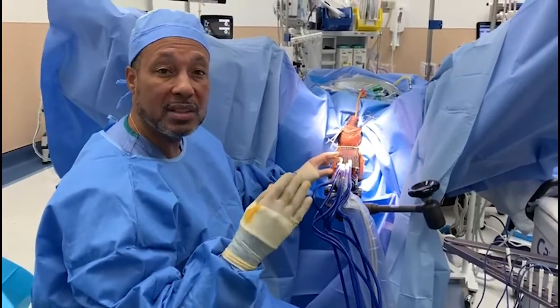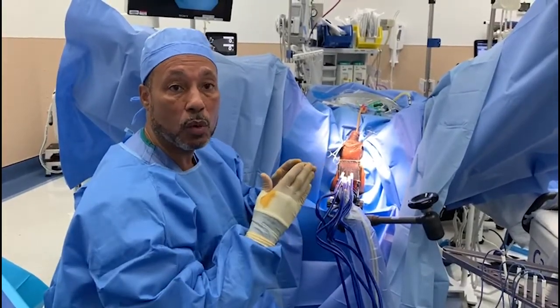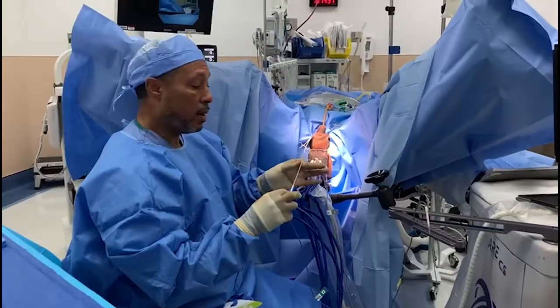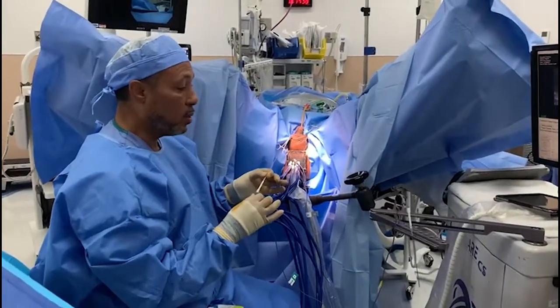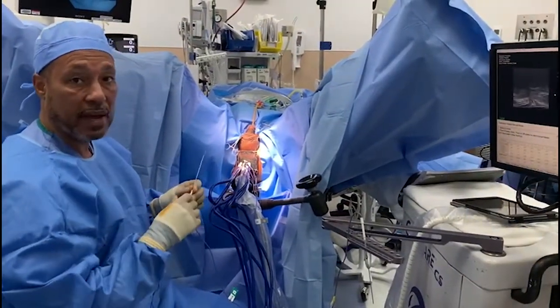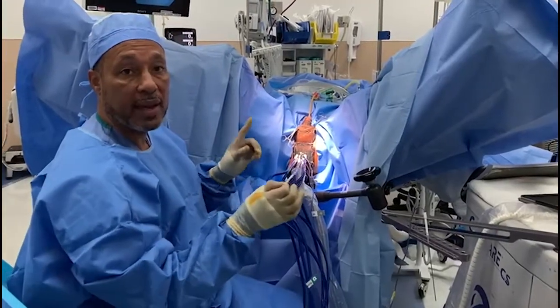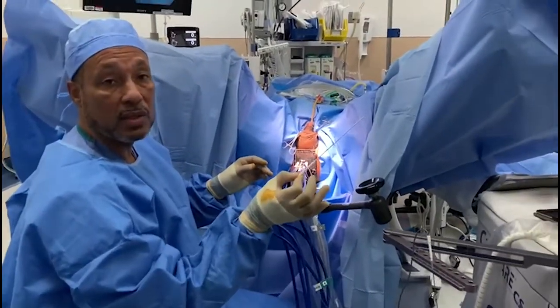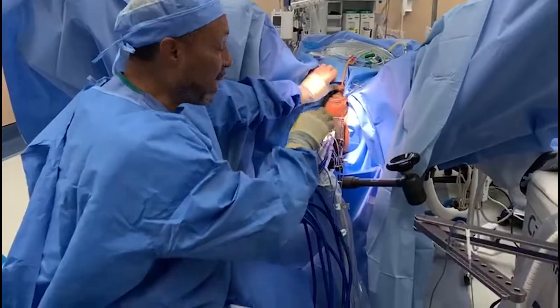We can adjust the length of the ice ball with this variable length adjuster. I usually go a few millimeters less than what it prescribes, so we can confine the freeze to the target zone without the ice extending beyond it. For our thermocouplers — the temperature sensors that surround and embed into the prostate — I use the Denonvilliers fascia placement first. I want to skive the Denonvilliers fascia so we have an accurate temperature reading. I eyeball the placement; there is a computer-generated grid pattern but I generally don't use it.